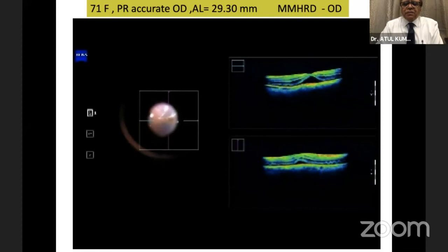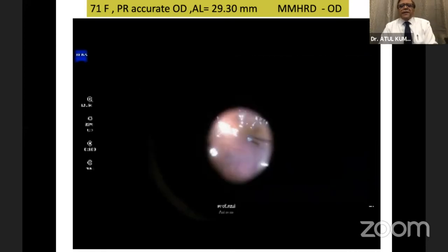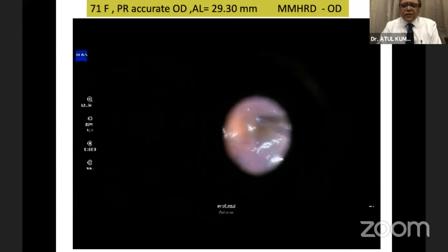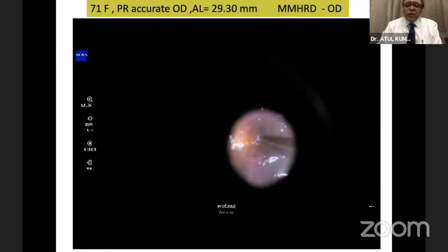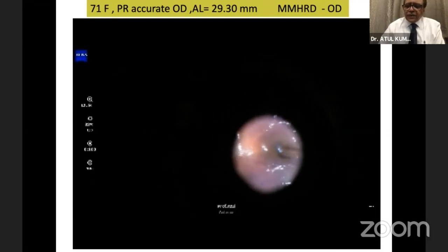And once under the perfluorocarbon liquid, you make sure that you do the OCT to see where exactly is the hole, and then you peel the ILM so that it covers the hole. So once you've got the blue colored ILM to cover the hole, then you make sure that the center, the macula, is also taken care of, as well as the periphery.